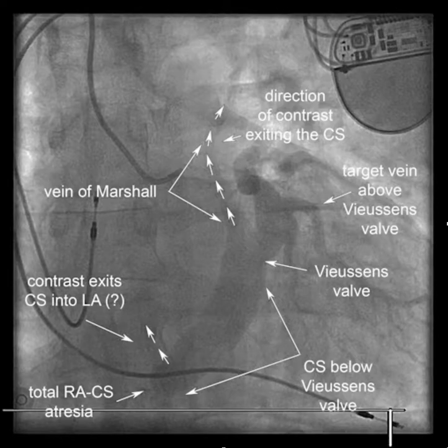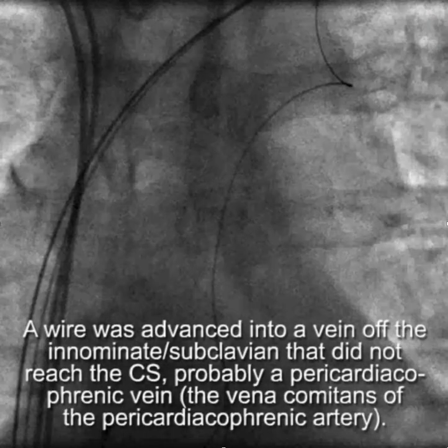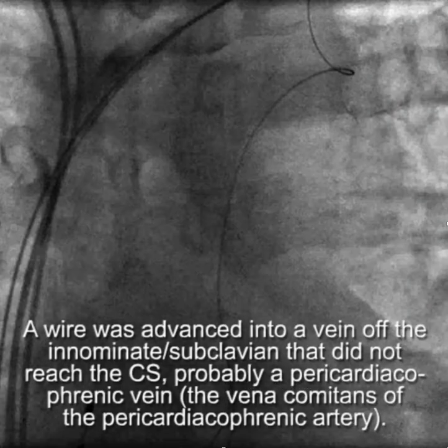So recognizing that there was a connection to the left subclavian, a wire was advanced into a vein off the innominate subclavian that initially did not reach the CS. In retrospect, this was probably a pericardiophrenic vein.